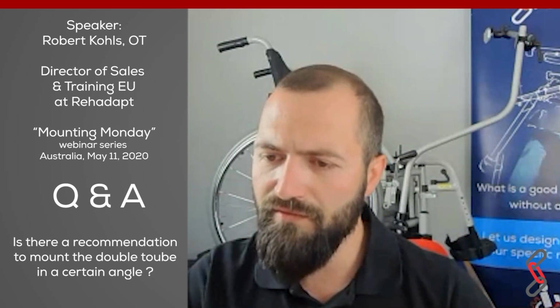So Simona has a quick question. You mentioned that the double mounts of the mount should be mounted horizontally to take more of the vibration. Is there a certain angle from the vertical that you would recommend, or just make sure you don't mount the double tubes vertically?